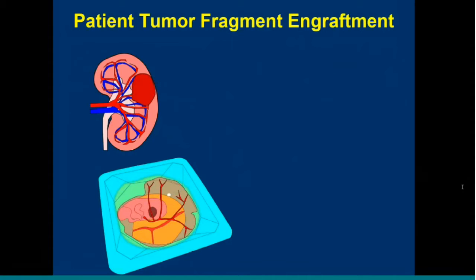These tumor fragments are allowed to rest for 2 days, so we can filter out all the fragments that did not take on the CAM or the animals that have died within that 2 day period. And then we begin a topical application of our selected anti-angiogenic agent or a vehicle control. For these studies, we've been mostly testing DMSO versus sunitinib.